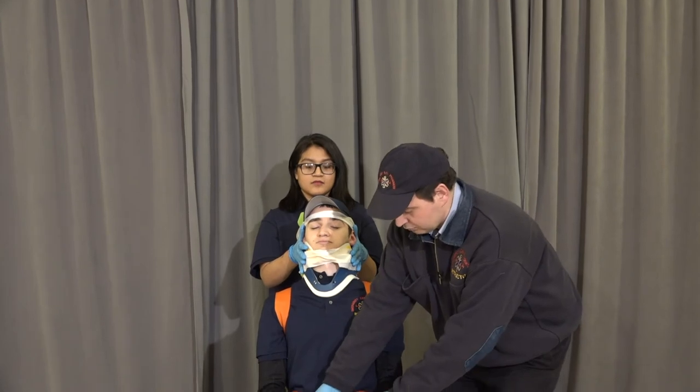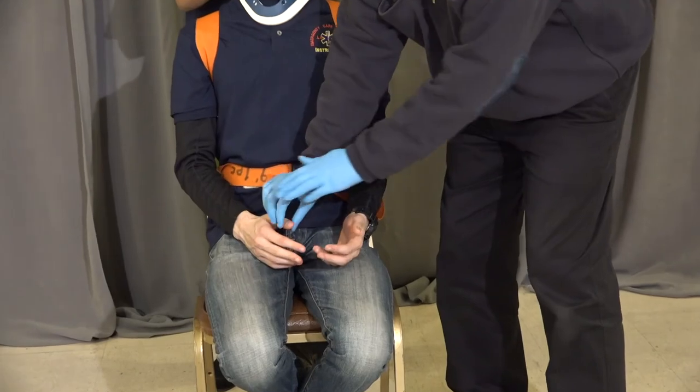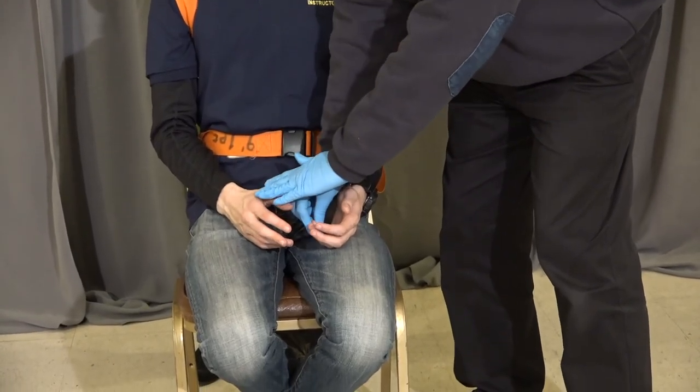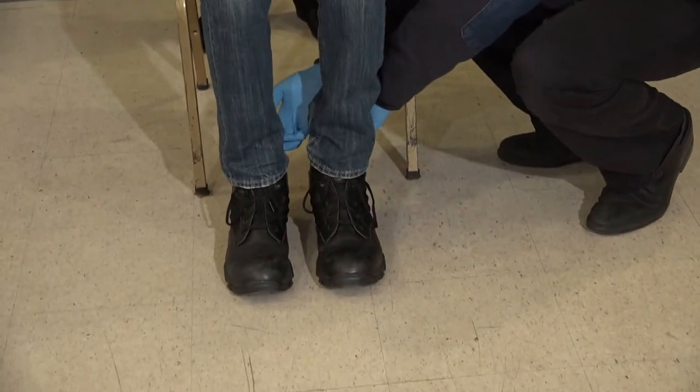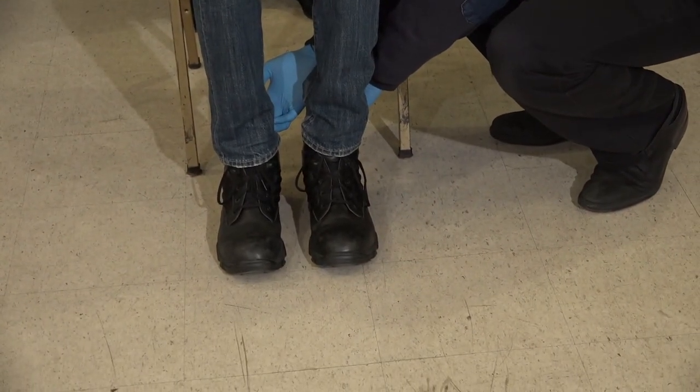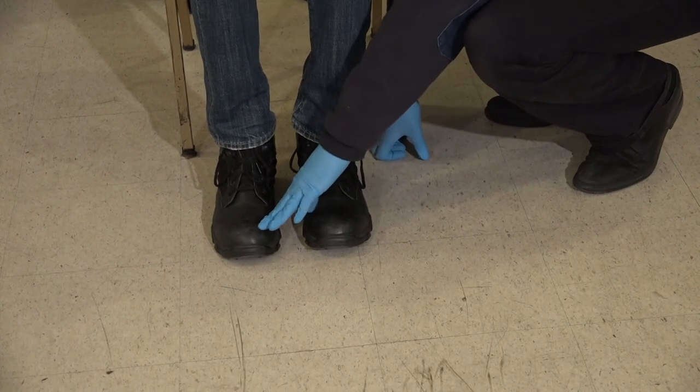We're going to recheck distal pulses. Wiggle your fingers. Which finger? And this? Thank you. Great. Checking distal pulses here. Wiggle your toes. Which toe? Little toe. And this foot? Big toe.